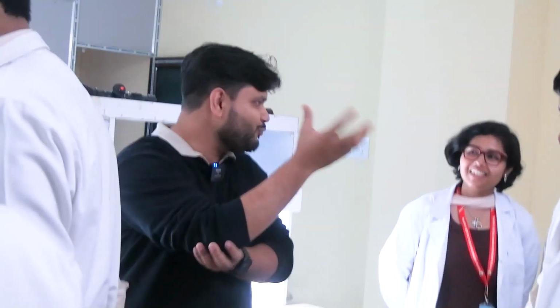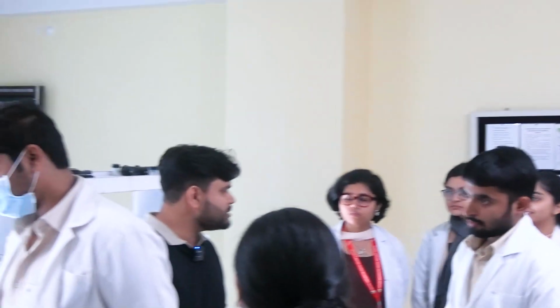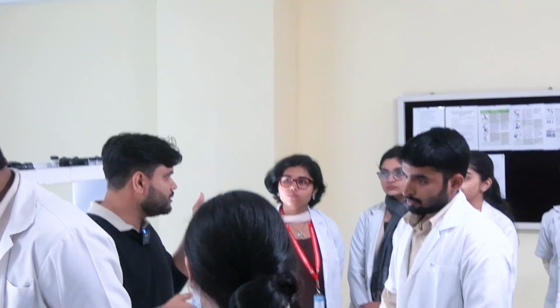Sometimes, for example, we have a very small sample of stool here, but if you don't tell the patient properly, he will present a large sample of stool and give it to you in a Swiggy box. That tiffin box we get when we order from Swiggy. This is a real life example. Okay, they've given a big box full of literal stool. So it's very difficult for us. So we have to concentrate the stool so that the things that we require are accumulated in one place.